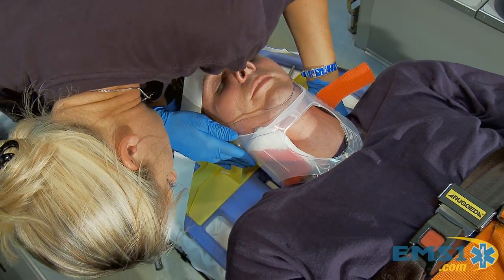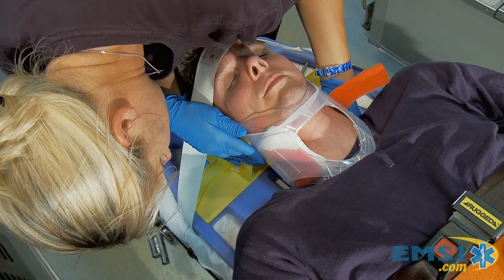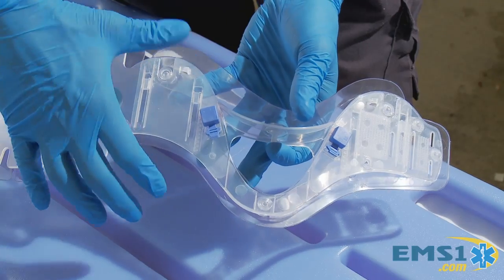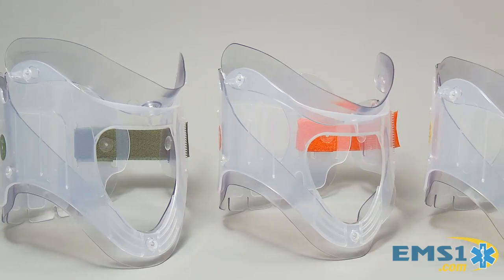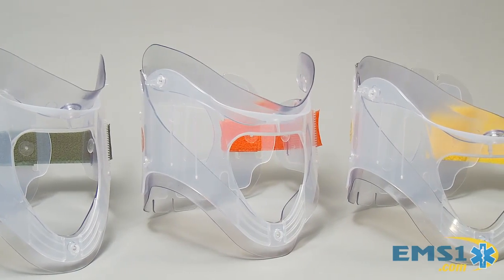The other thing about it is that you can see through it. They have an adjustable version now, but they also have a pediatric version, a very small infant version, and a tall neck version. So multiple sizes, or you can just carry one adjustable. You have a choice.